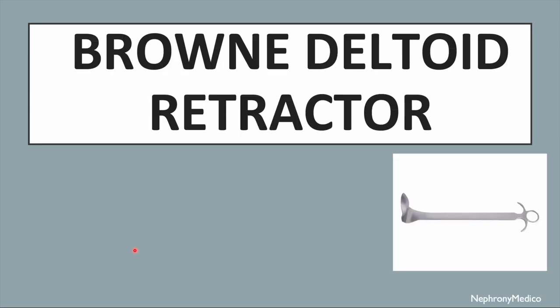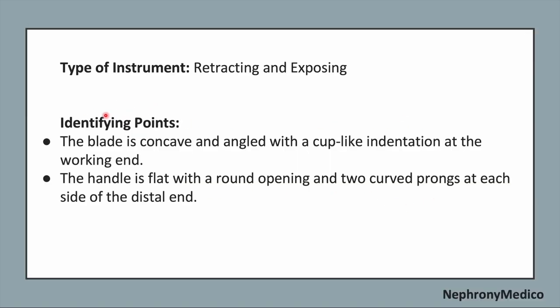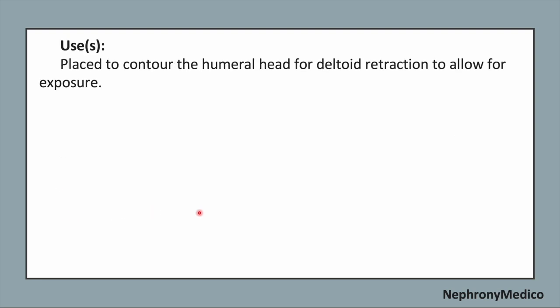Let's talk about Browne deltoid retractor. This is a picture showing Browne deltoid retractor. It is a retracting and exposing type of instrument. Identifying points: the blade is concave and angled with a cup-like indentation at the working end. The handle is flat with a round opening and two curved prongs at each side of the distal end. Use: it is placed to contour the humeral head for deltoid retraction for overall exposure.